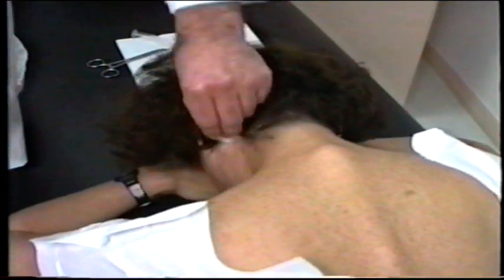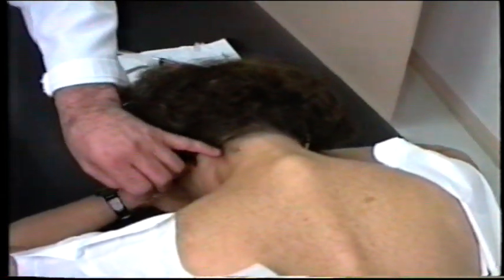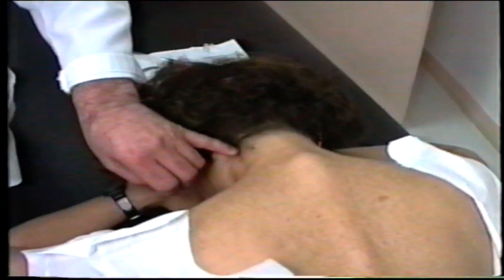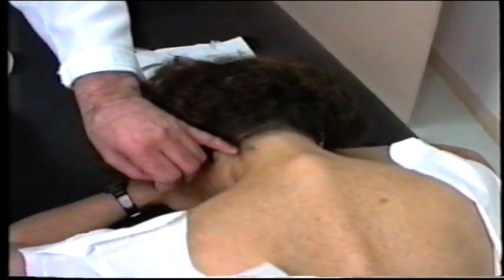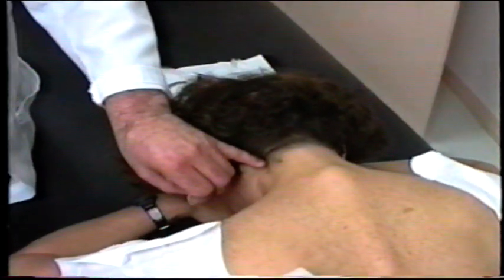Again, utilizing the posterior lateral approach with the tip of the needle directed caudally, I'm identifying the painful areas. Is this the one, Janet? Mm-hmm. Is this bringing you the radiating pain down the left arm? Mm-hmm. Yes? Yes. Very good.